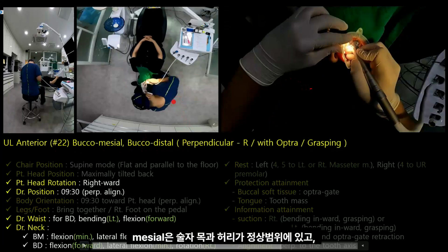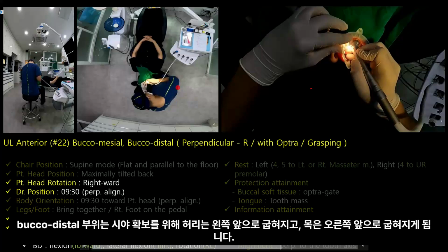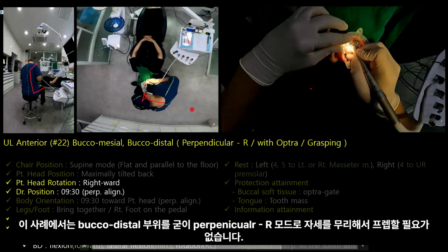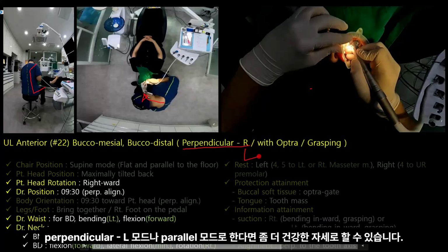When preparing the bucco-distal area, in order to get a clear view of that region, the operator's back will naturally bend forward and to the left, while the neck will slightly bend forward and to the right. It is generally advisable to avoid positions where the body is significantly bent, like a D. In this particular instance, there's no need to unduly strain your posture by forcing yourself to prep the buccal distal area in a perpendicular R mode. You can achieve a healthier posture by utilizing either the perpendicular L mode or the parallel mode.